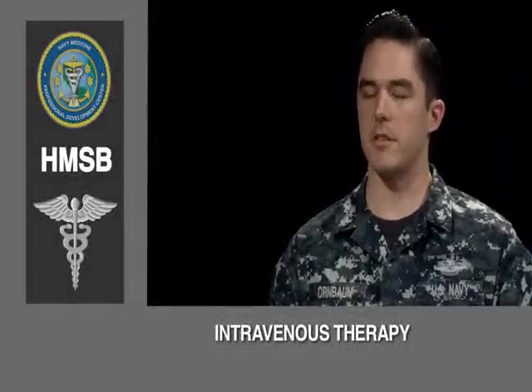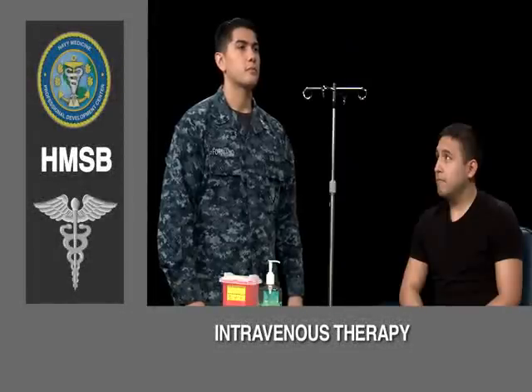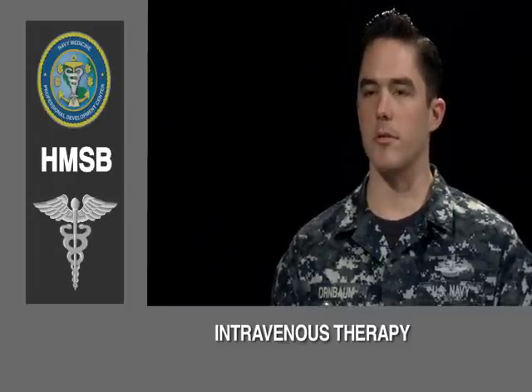This is the Intravenous Therapy Skills Evaluation. Your objective is to demonstrate appropriate selection and preparation of a vein based on prescribed use and type of IV therapy. Demonstrate preparation and perform IV insertion. Calculate flow rate. And discontinue IV therapy and document on appropriate forms. Do you have any questions before we begin? No. Begin when you are ready.